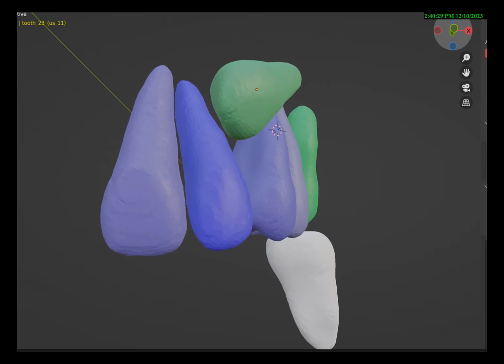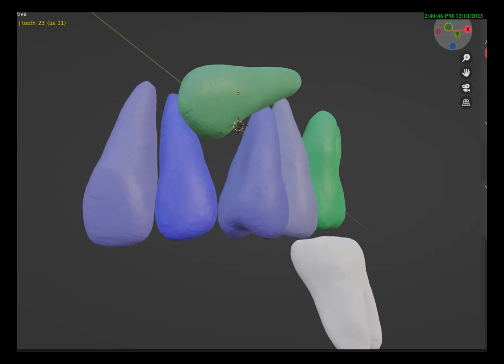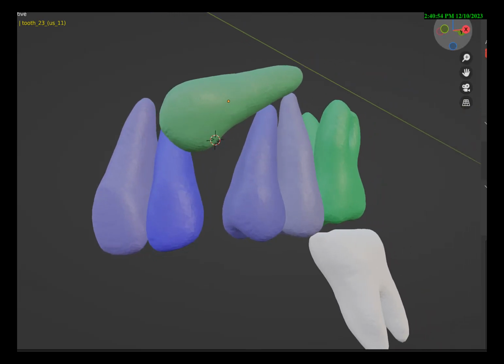Something that needs to be remembered too is that once the space is open, before you put a simple force to a wire, you want to stay away from the lateral crown. So all of this has to be taken into account, and obviously the center of rotation, and where the apex is going in relation to where the crown is going, has to be calculated.